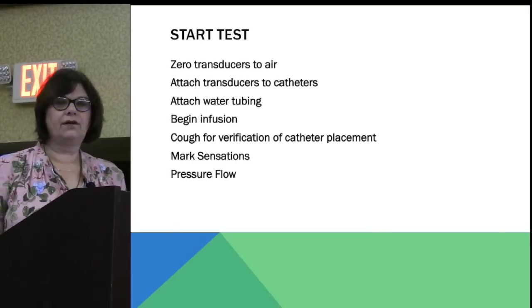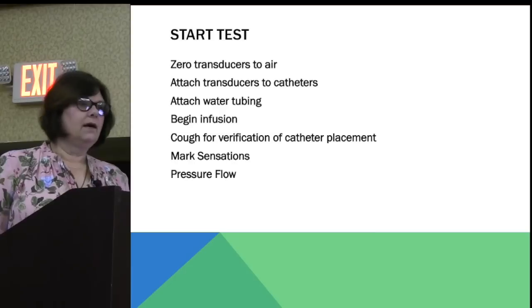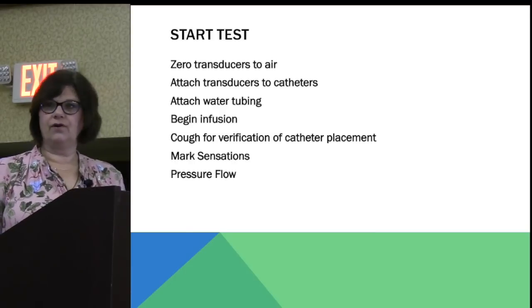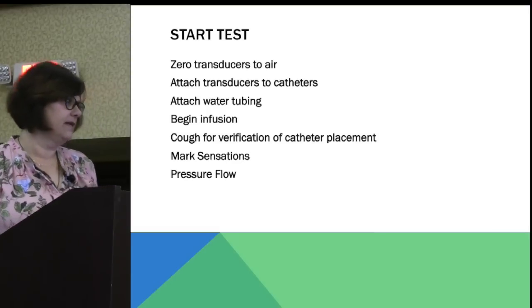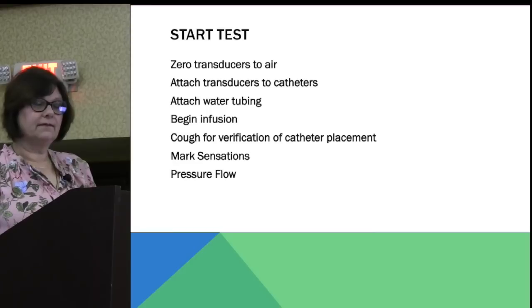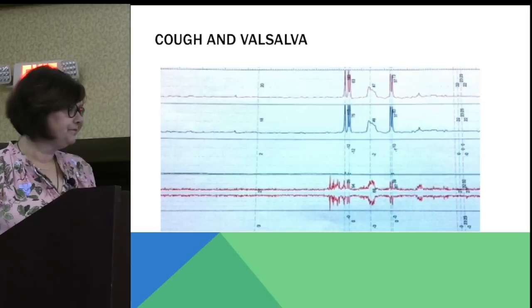Then as the test goes on, you're going to mark your sensations on the test. Everybody who has a system knows that you've got your first sensation, second sensation, sense of filling, those kinds of things. And then at the end of this whole filling, after you fill the bladder to capacity and you've gotten your information, the last piece of this is your pressure flow.